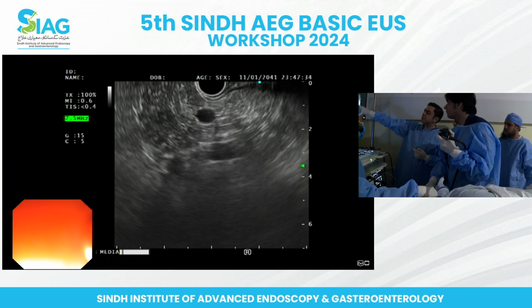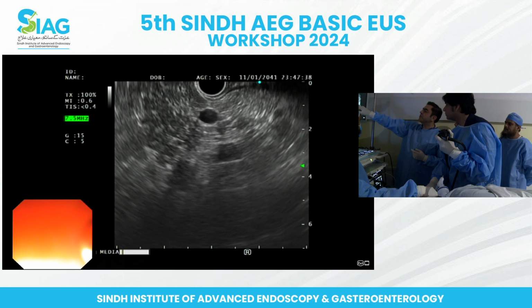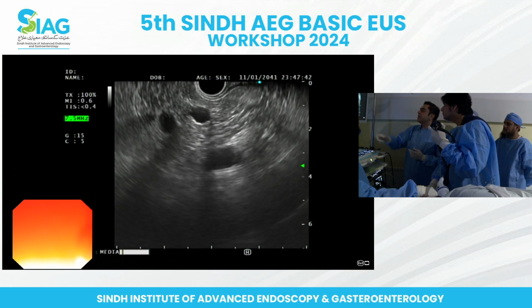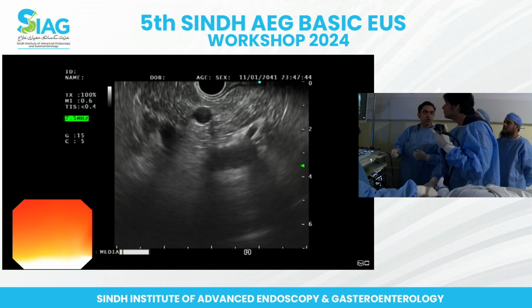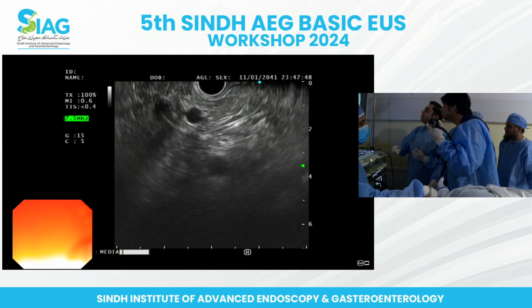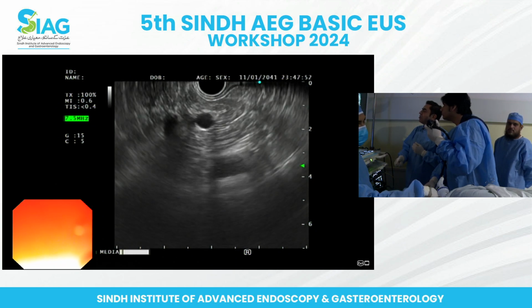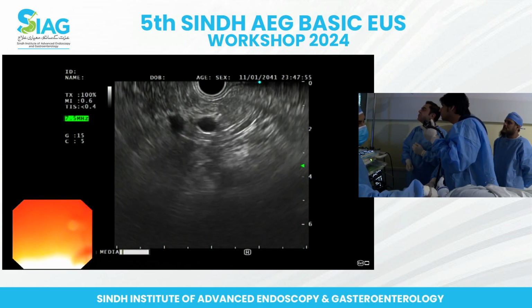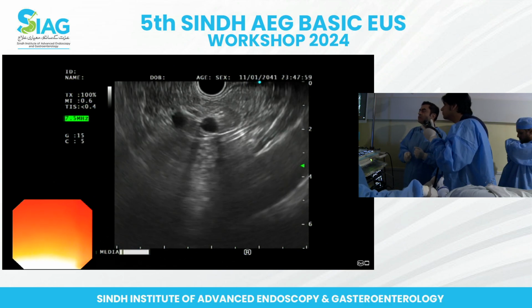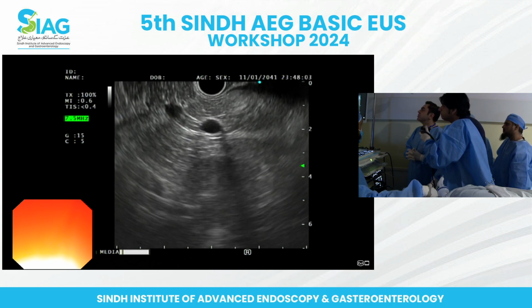The splenic vein is probably down there. That's the pancreatic tissue. Now see if you can trace that all the way to the hilum. Do a clockwise torque. Now these vessels are a bit tortuous, so you'll be moving up and down, and they may be coming in and out of view. But if you keep this in the center, yeah, excellent, and now keep on doing the clockwise torque, you should be able to reach the spleen. And don't put too much force. If you feel that the scope tip is getting stuck in the hernia, then don't push too much, okay?